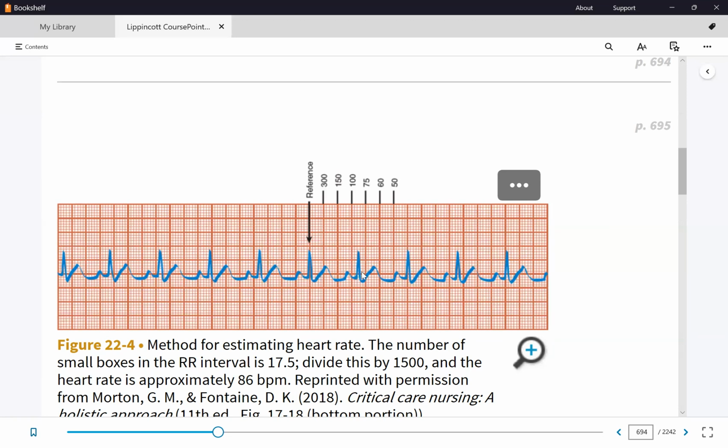Yeah. Okay. However, since this is an incomplete heartbeat, and I'm also missing a P here, if I move it, because I don't really have to count here, right? If I put this P here, can this now be in my 6 seconds? Yes. So do I have 6 or 7? 7. So what is my estimated heart rate? 70. Is it really 70 or is it 70 something? It's 70 something. We don't know exactly.